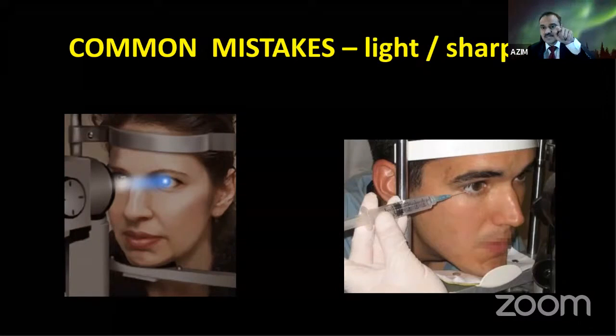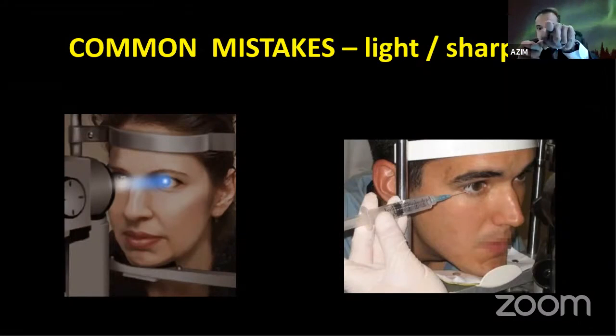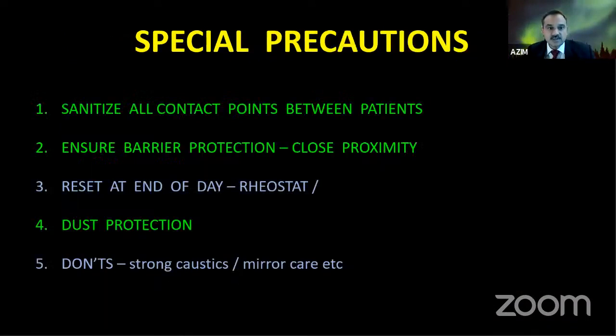Sharps: never keep the sharp pointing towards the patient and go with the slit lamp like this. Very dangerous, remember. Keep it away, rest it on your frame. Once you're confident, bring it into your field, then slowly go in. All right, there are some small tips which are important. Remember to sanitize all points and ensure barrier protection, to make sure you're safe. Make sure you reset the machine at the end of the day to low light, so that the next patient will be okay. Dust protection, don't use strong caustics, mirror care, I already told you.